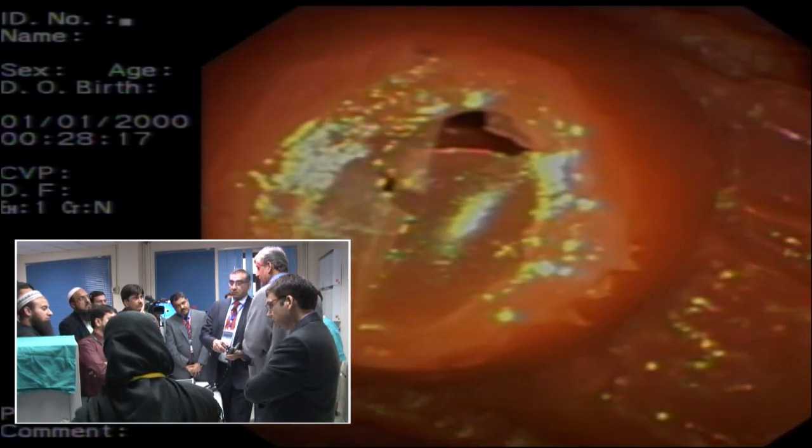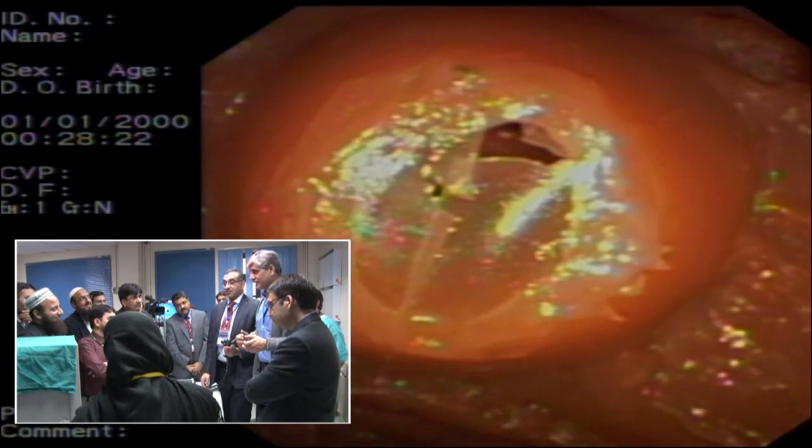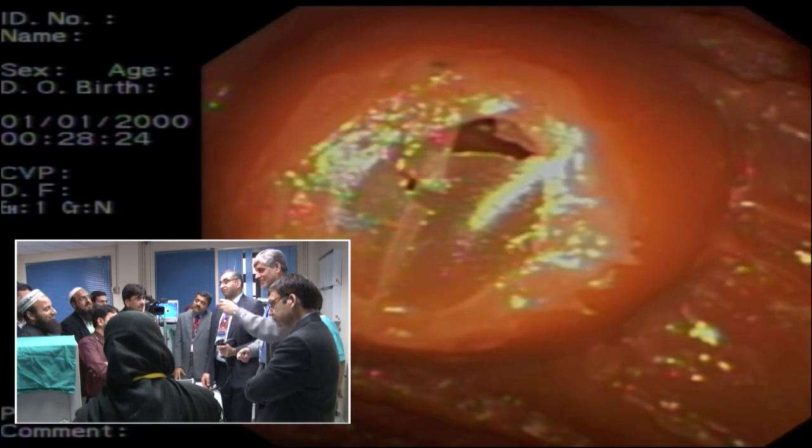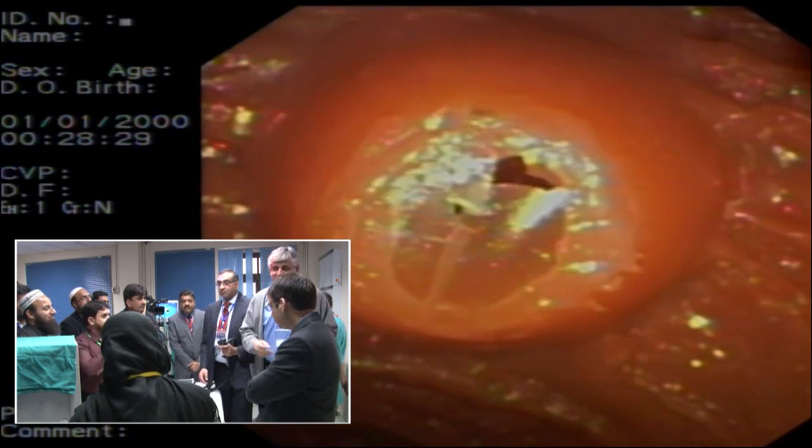you give it to your junior, and the ampulla is all gone. And he is struggling, and in that struggling, he's trying to push the scope, advance the scope, do this, and he's messed it up. You come back, and all you do is just turn yourself and say, here it was.